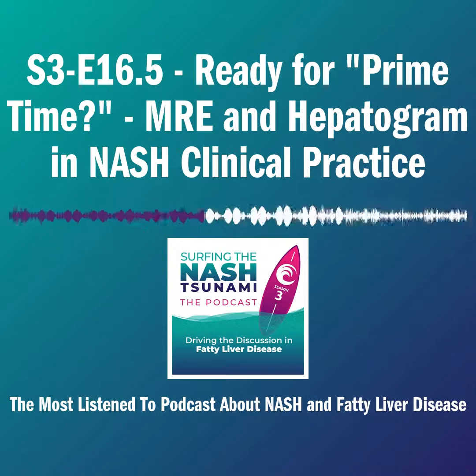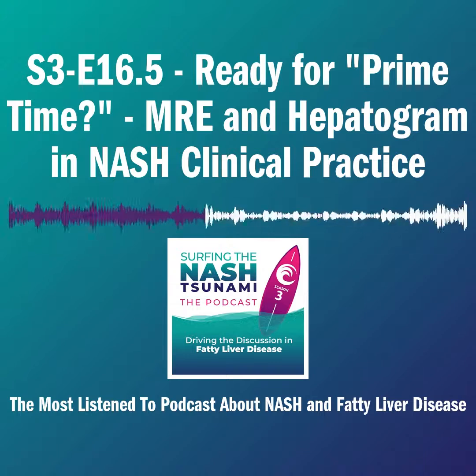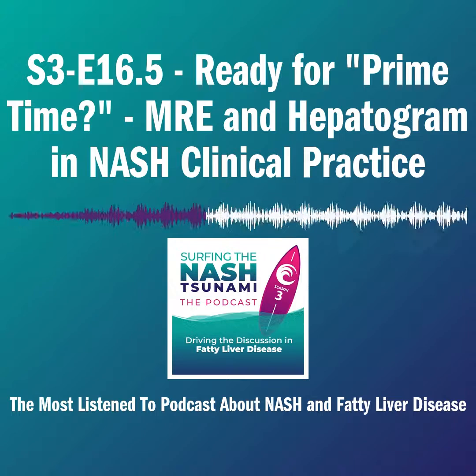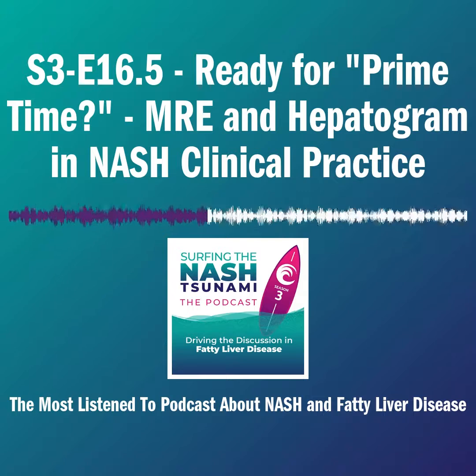And for new or existing MRI scanners, adding the MRE application isn't challenging and should cost less than purchasing other non-invasive devices such as FibroScan. And for the actual exam, we've already talked about this, but if the clinician orders just an MRE and PDFF, or MRE-PDFF, this is a low-cost rapid exam. Based on the 2019 CMS data here in the US, the cost can be around $170. So MRE can be cost-effective.